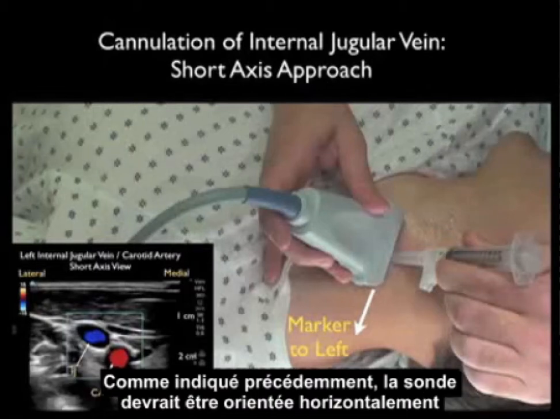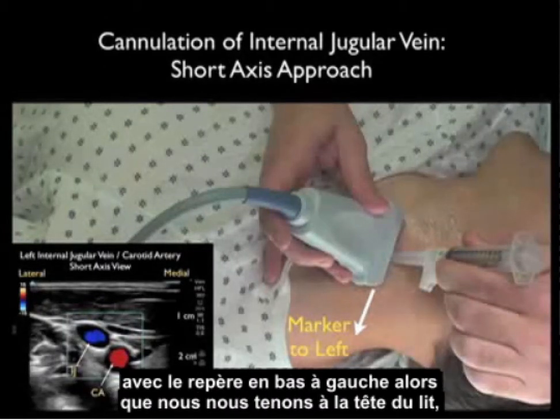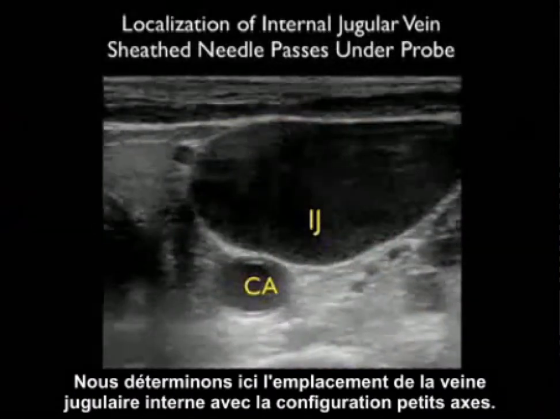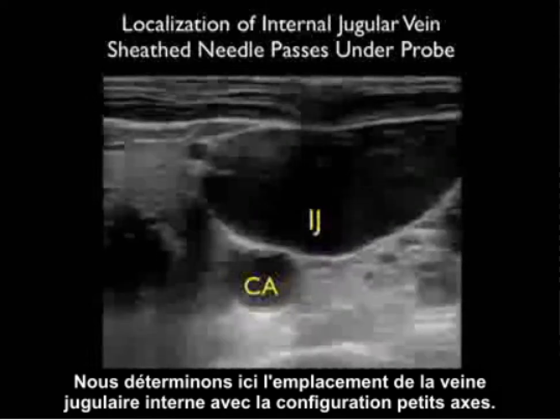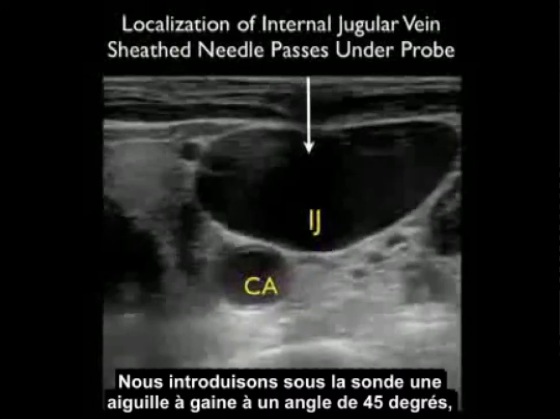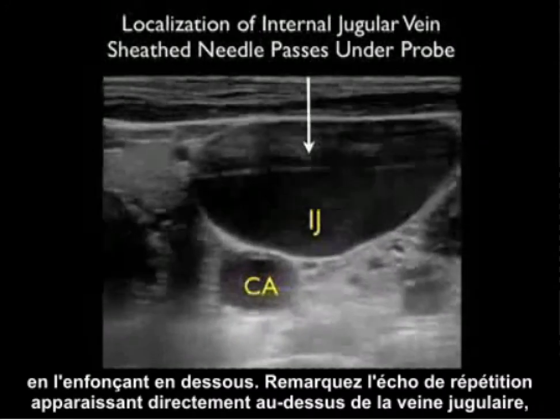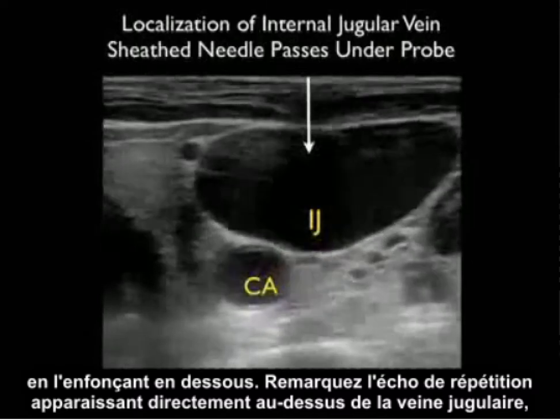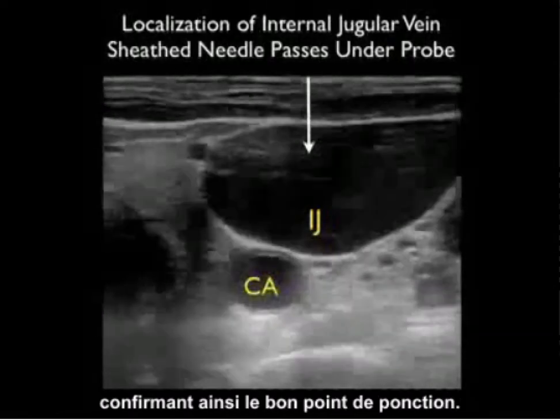As we discussed prior, the probe should be oriented in a side-to-side orientation with the marker down towards our left as we stand at the head of the bed, so it orients directly to the screen indicator dot which would be oriented towards the left of the ultrasound screen. Here we're localizing the internal jugular vein using this short axis configuration. We're coming in underneath the probe with the sheath needle at that 45 degree plane, pushing in underneath, and notice the ring-down artifact coming in directly on top of that internal jugular vein, telling us this is the correct puncture point.